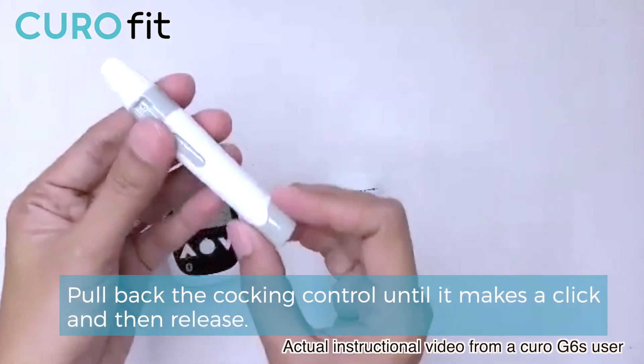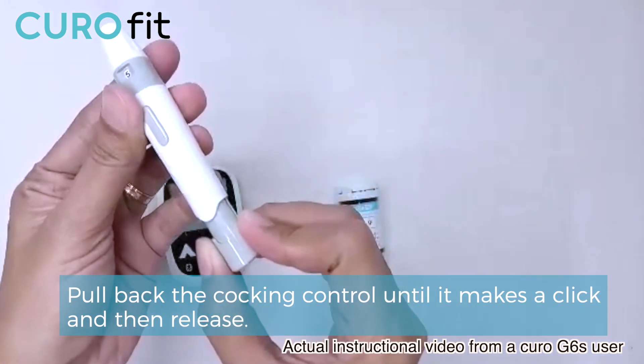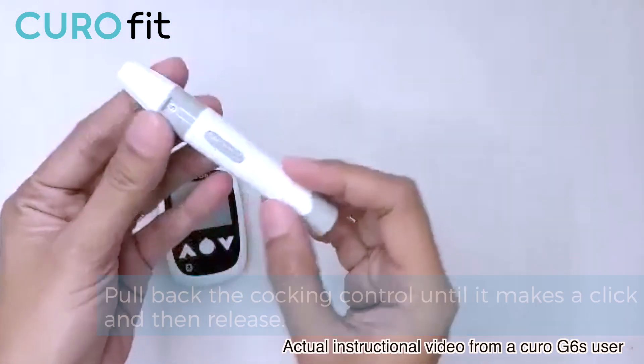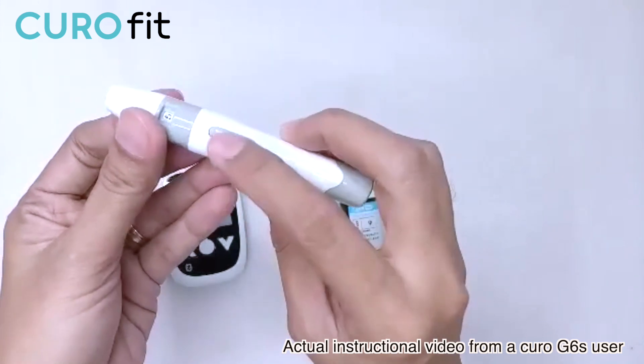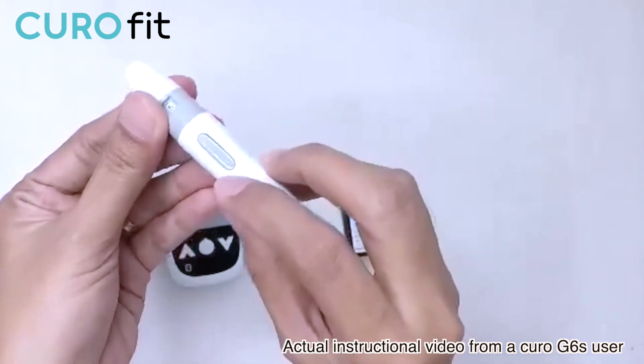To arm the lancing device, just pull the end back. Then, when you're ready to prick your finger, just push the button at the center.